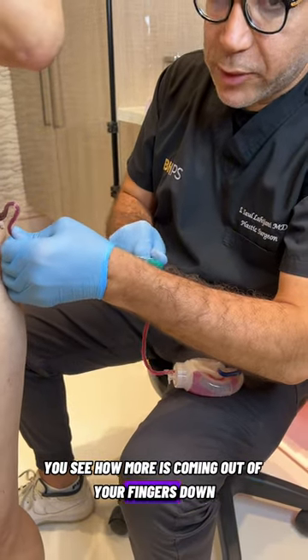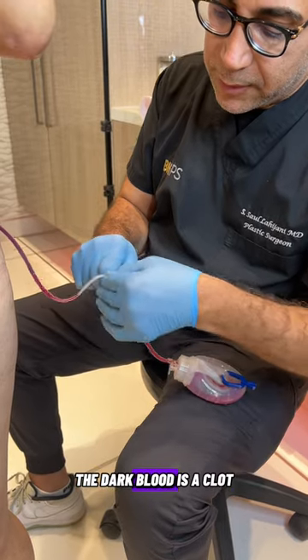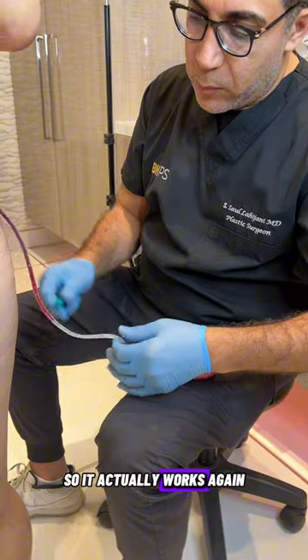Move your fingers down, milk it more. And you can see there's a clot right there. The dark blood is a clot. And you want to move all this down so it actually works.